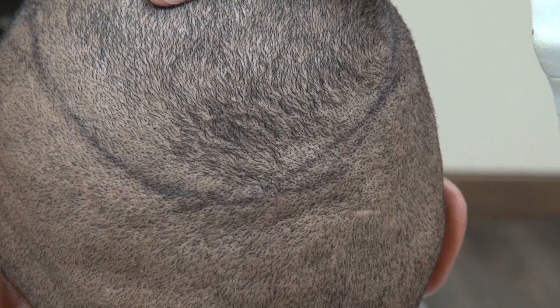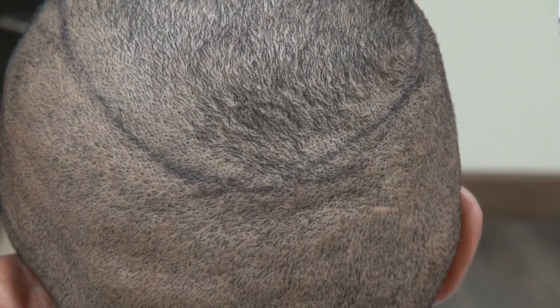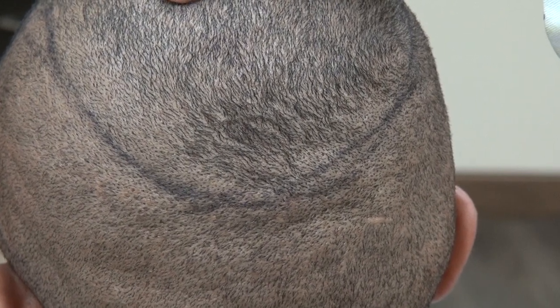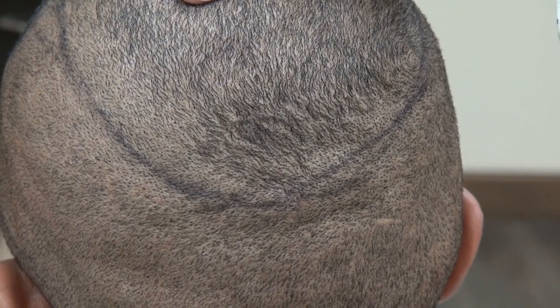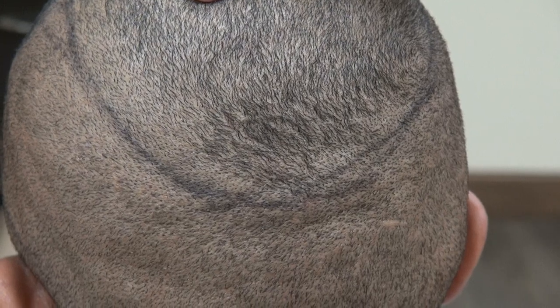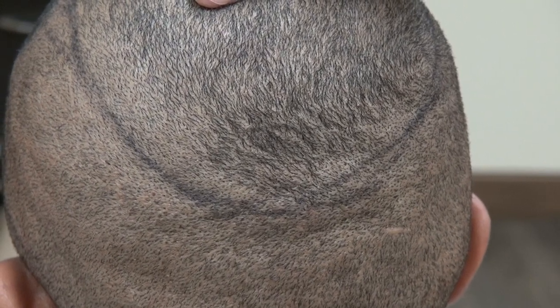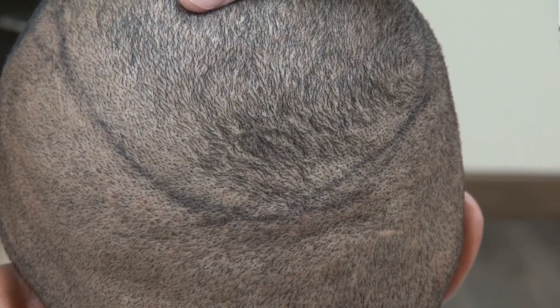This is a demonstration of the 1.0mm FUE tip donor scar after two surgeries on an African-American client who is a physician himself. He did thorough research and found that I am a specialist in FUE. As you can see, the result with the 1.0mm tip is fantastic — it is hard to see the scarring.